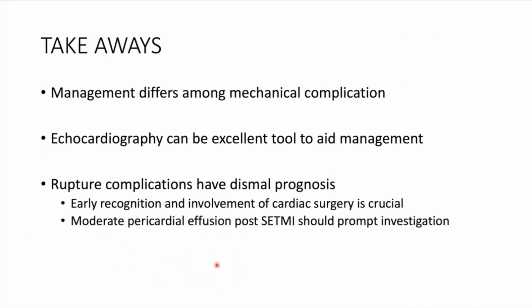Okay, so that's free wall ruptures. Just some takeaways from the talk. I tried to show that management differs for each kind of mechanical complication that you encounter. Echo is a really useful tool in not only diagnosing but also managing these patients. And sometimes it's purely an echocardiographic diagnosis, in the case of LVOT obstruction. Rupture complications have a very, very poor prognosis, and it's very important to recognize these patients early and to get cardiac surgery involved. If you see a moderate-sized pericardial effusion after a STEMI, it should prompt further investigation.